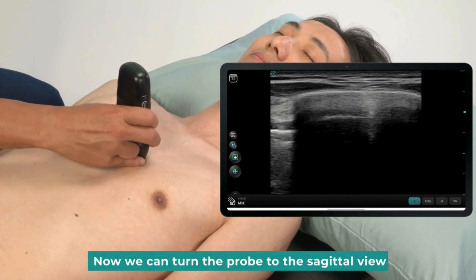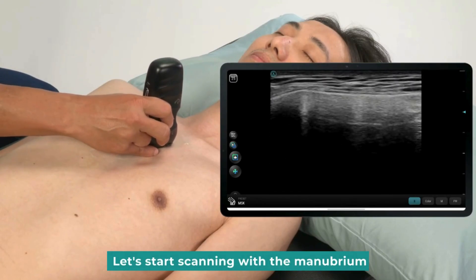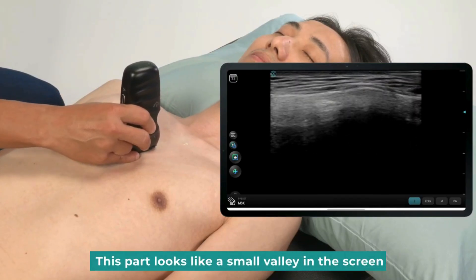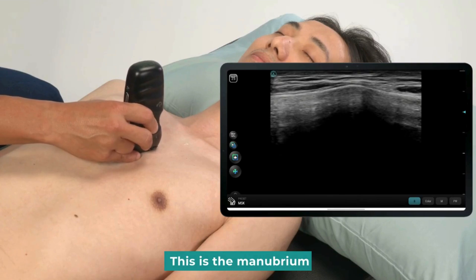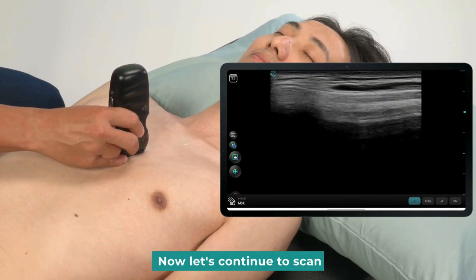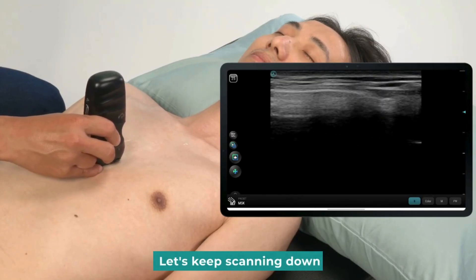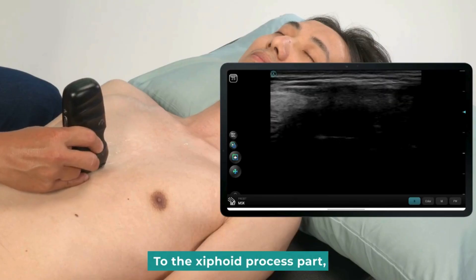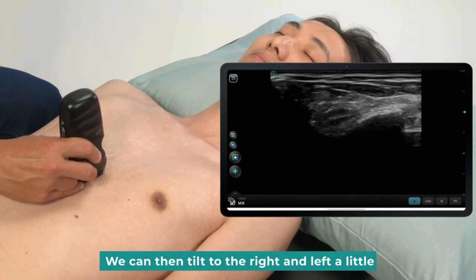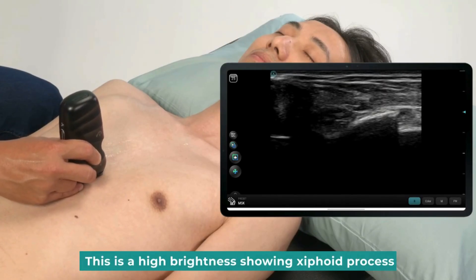Now we can turn the probe to the sagittal view to start scanning from top to bottom. Let's start scanning with the manubrium and slowly slide down. This part looks like a small valley on the screen — this is the manubrium, the junction of the sternum. The sternum surface is a very flat cortical line. Let's keep scanning down to the xiphoid process part. We can then tilt to the right and left a little. We can see a curve at the bottom — this high brightness is showing the xiphoid process.